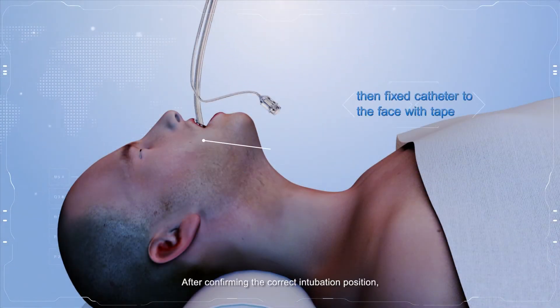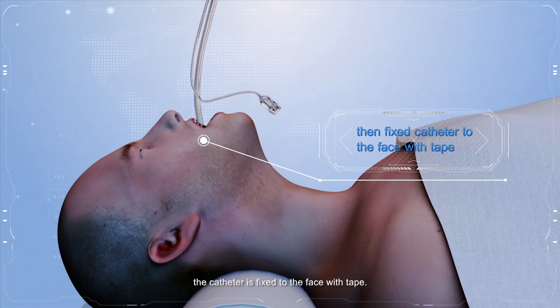After confirming the correct intubation position, fix the catheter to the patient's face with tape.